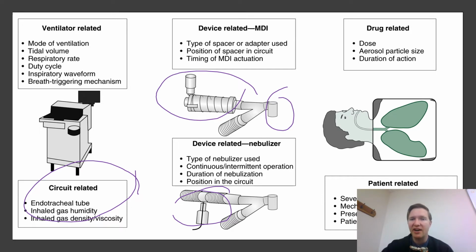Drug-related, the aerosol particle size, the duration of action. So there's a lot of stuff that we have to look at. What's the patient positioning in, right? So we're going to have a lot of factors that go in here. Like I said, this gets more dynamic when you add life support into the picture. So let's sort of talk about these.